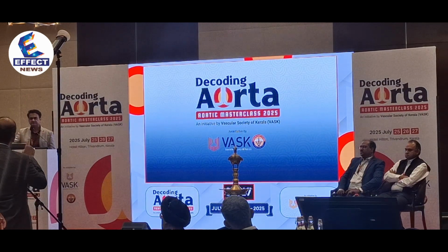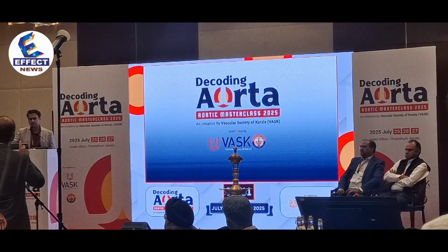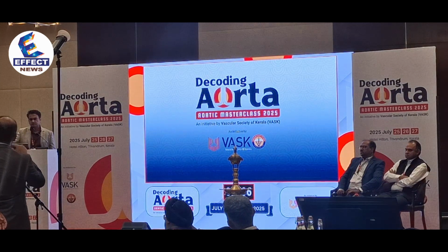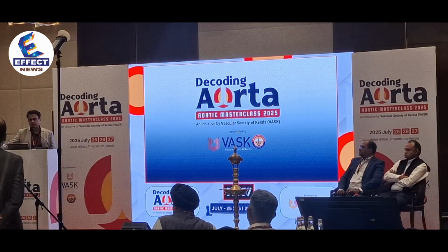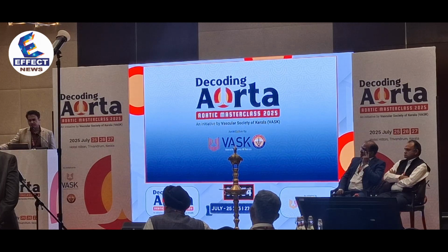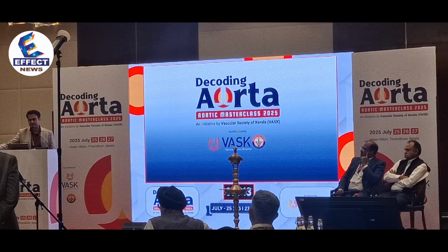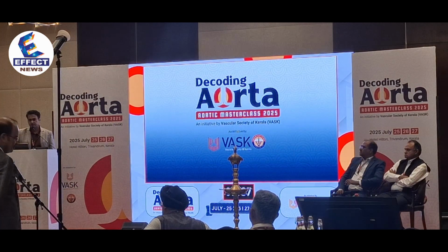Nice presentation. Quick thing on contrast enhanced MR. You mentioned that contrast enhanced MR can be used in renal insufficiency. Yeah. My understanding is gadolinium, even though in patients with renal insufficiency, you cannot use when the GFR is less than 30. Can you clarify? That is true. I mean, there is a theoretical thing about nephrogenic systemic fibrosis, but of late, in our radiology department, we have been using MRI left and right even for CKD stage 5 patients, and this is an extreme rarity, and we never had the bad luck to see it. Using gadolinium. The new gadolinium, I think it's a newer agent.